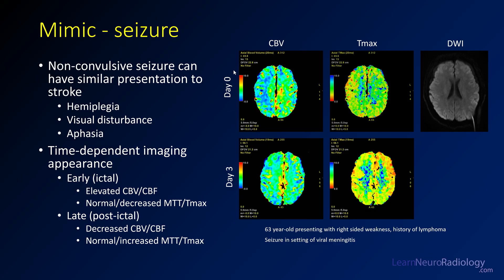Here you see a patient who presented with a seizure. On the day of their seizure, with right-sided weakness suggesting a left hemisphere abnormality, you can see abnormal white matter and the whole left hemisphere has elevated blood volume — it's actually increased. The Tmax, on the other hand, is relatively maintained. By day three, blood volume has decreased to more normal or slightly decreased on that side, with more blue areas in the left hemisphere, while Tmax remains normal. This patient had an MRI showing no diffusion abnormality, so we're not dealing with stroke. In the late phase, blood volume can be slightly decreased and MTT or Tmax can be normal or slightly increased.